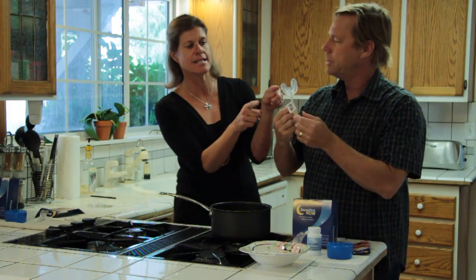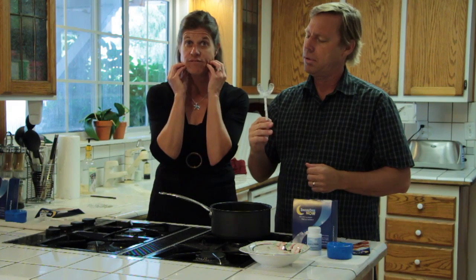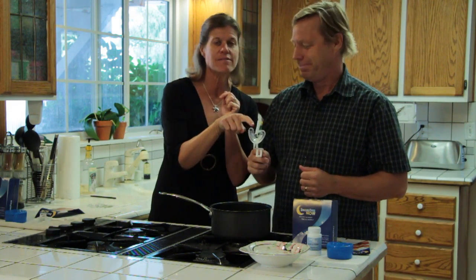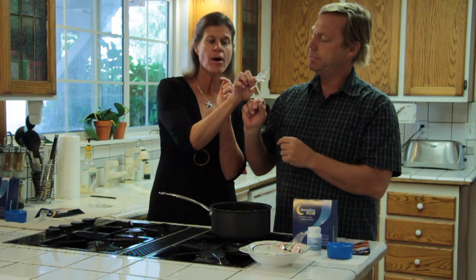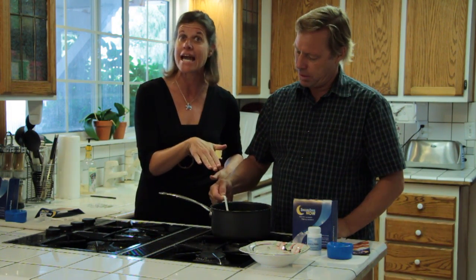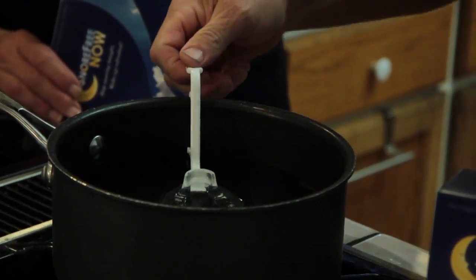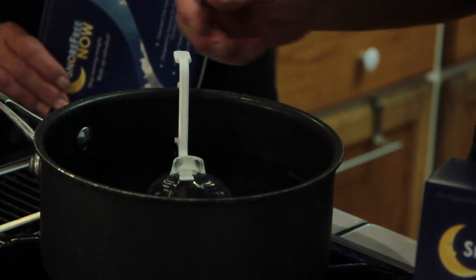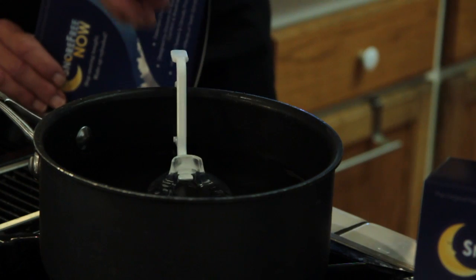Now, as we look at this, you can see there's a U shape. That's what actually fits into your mouth. Then we have the flange. That part, do not put in the water. So that's how we can tell. Let's go ahead and see how Roger did it. Notice how it fits perfectly in there. The U shape is submerged in the water, and the flange is out.